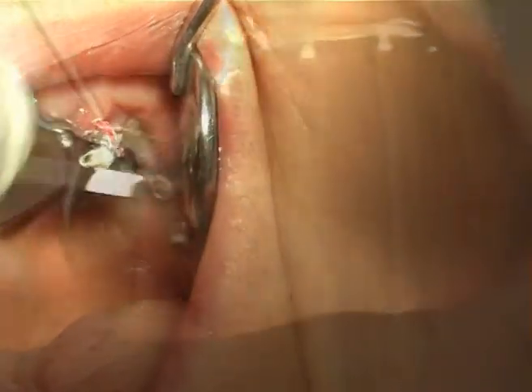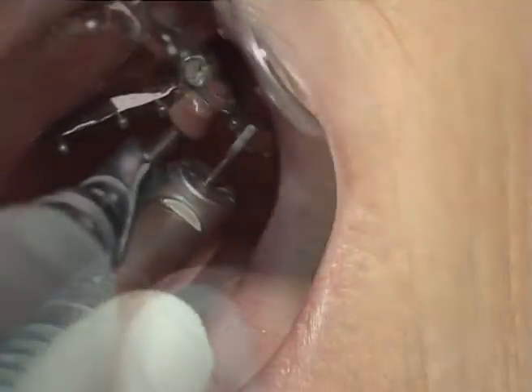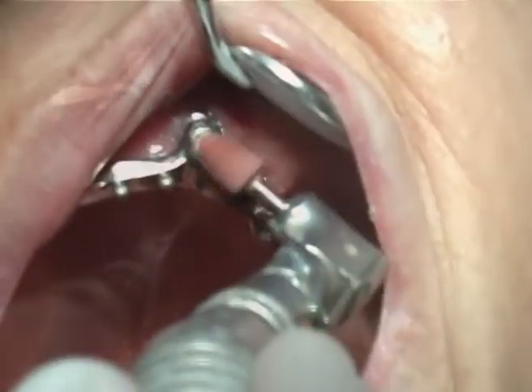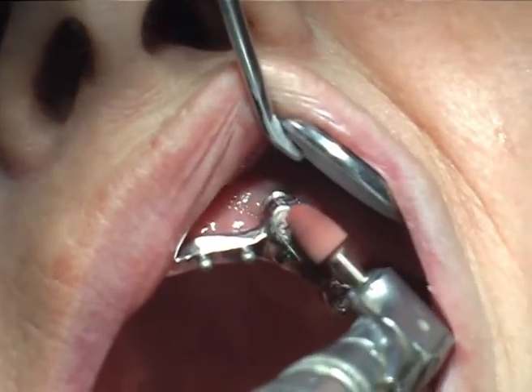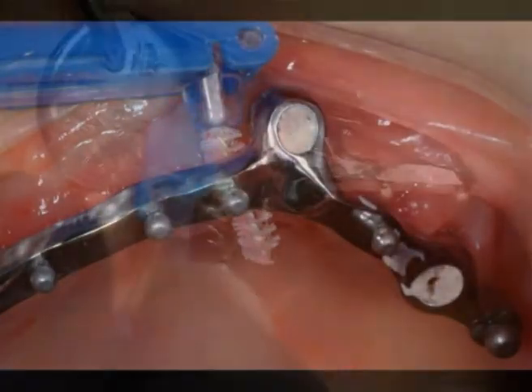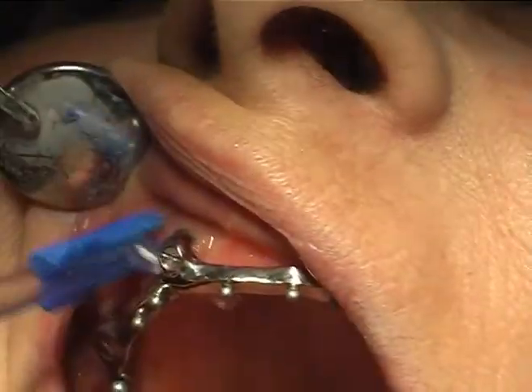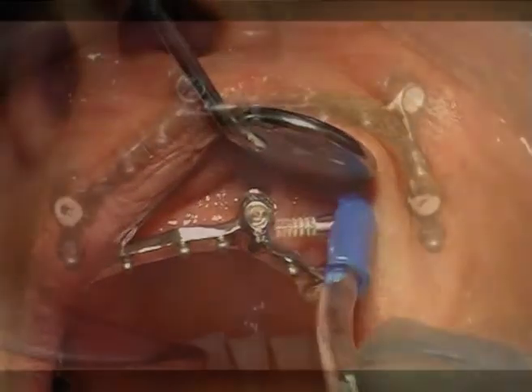Any excess material coming off the gingival ridge can be easily removed thanks to the soft wax barrier. Educate the patient to perform very good daily hygiene, using the proper devices to brush every area in order to avoid plaque accumulation.